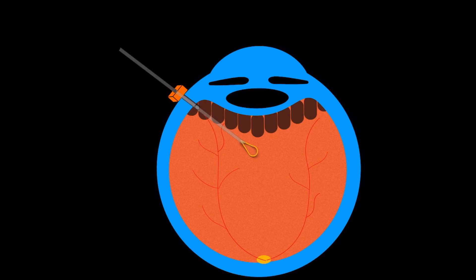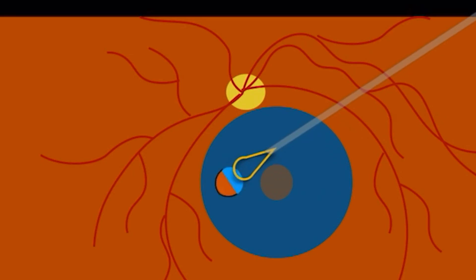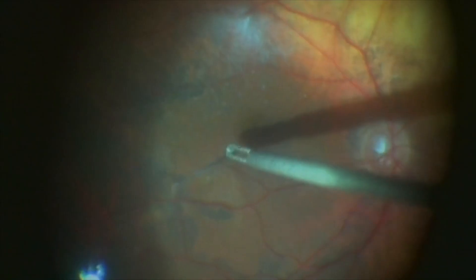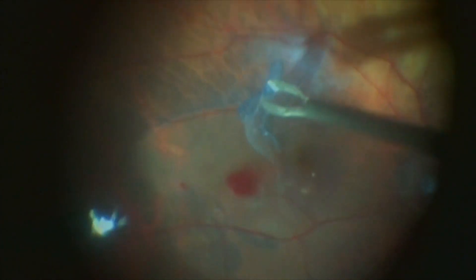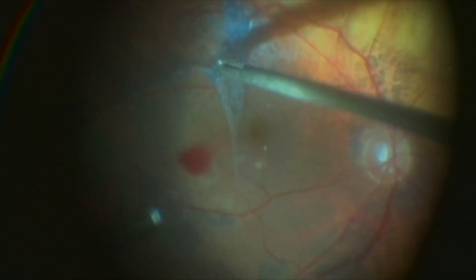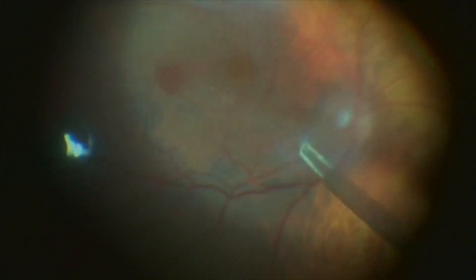In this case, the surgeon used the Flex Loop to create a first edge, making it easy to grasp the thick membrane and remove it completely with forceps without further traction in the perifoveal zone. The retinal membrane in this procedure appears to have been removed together with the residual posterior hyaloid at the posterior pole, possibly due to vitreous traction.